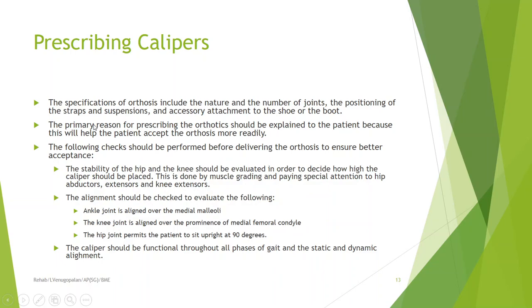to be wearing a hip, knee, ankle, foot orthosis, unless the problem with the arch is actually causing problems in the hip, right? So you have to do a thorough evaluation before you give away a caliper. So there are certain guidelines or certain rules that you need to keep in mind before prescribing a caliper.